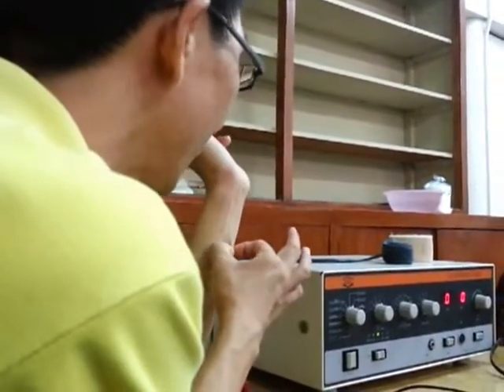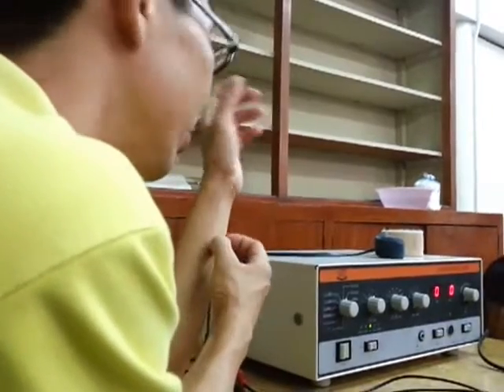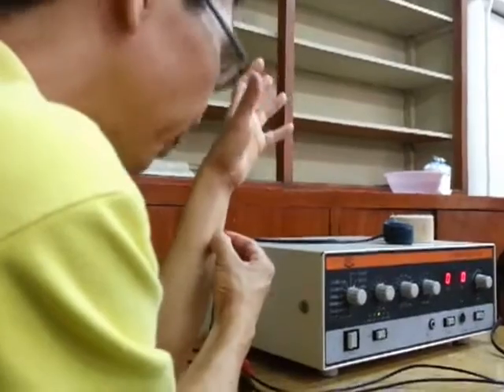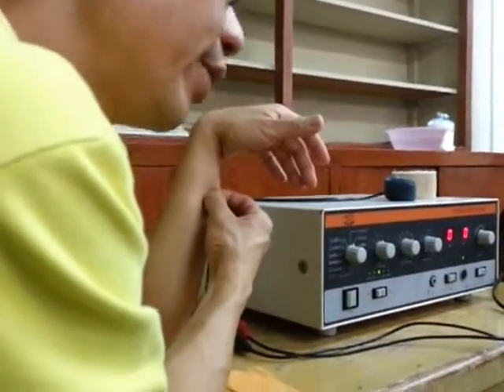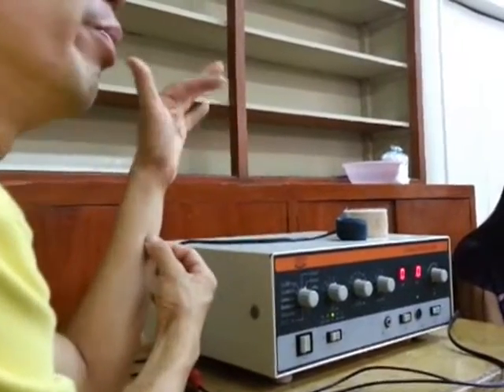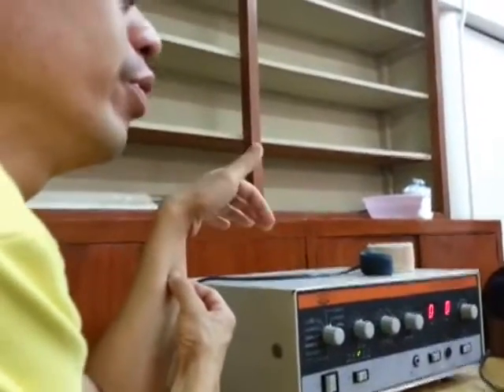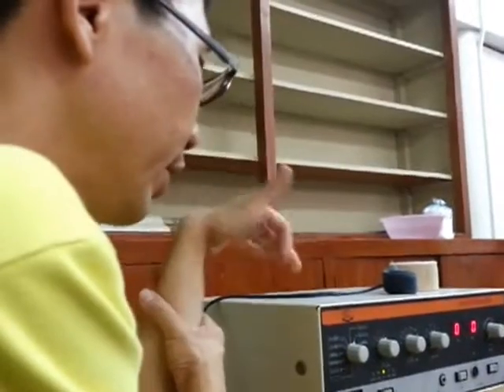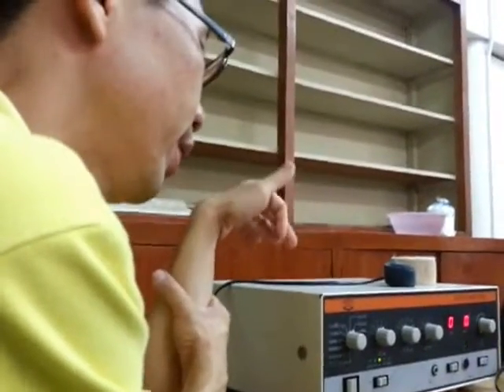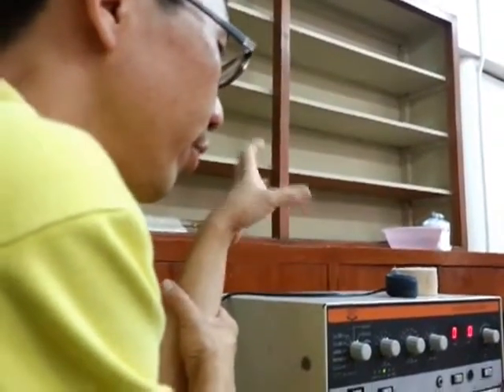So you need to keep the current on longer so that you can let the muscle do its action potential or depolarize. So the pulse duration is longer if denervated. If innervated, the pulse duration can be short or long.